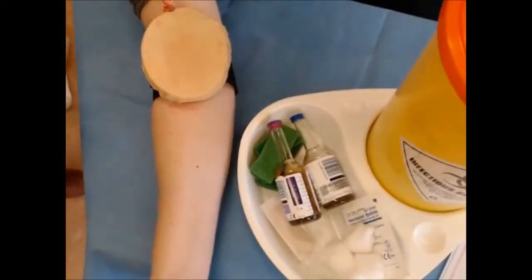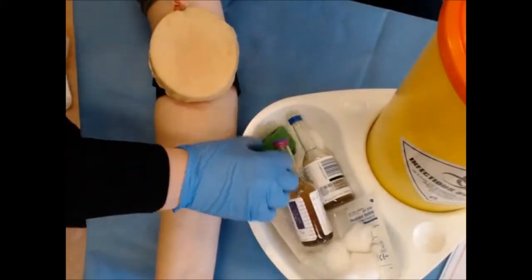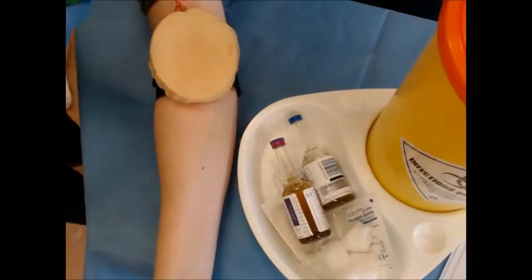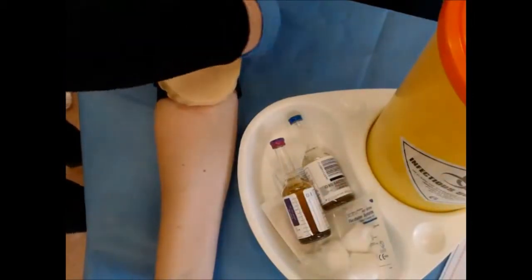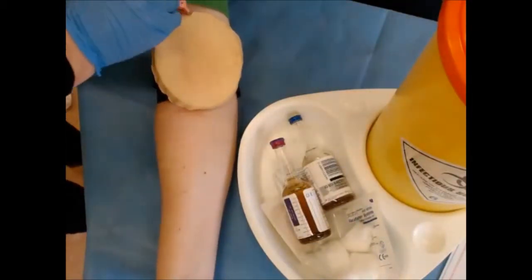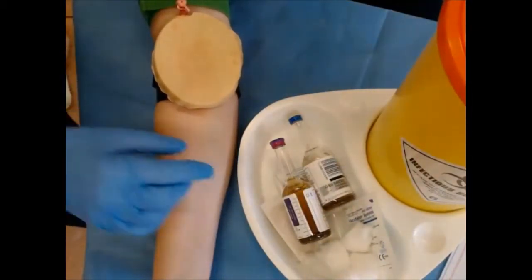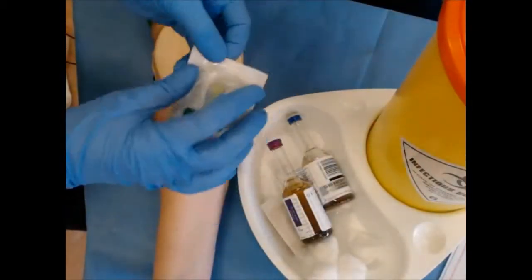OK, so you can take the sample from the antecubital fossa. You would palpate and find a suitable vein. Clean your hands, put on your gloves, apply your tourniquet and set up your equipment.